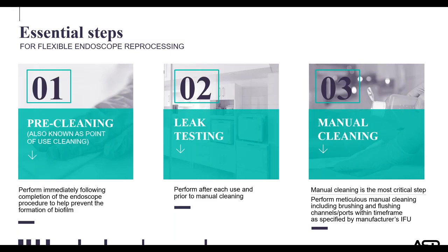And if a detergent or enzymatic adheres to that scope, it can impede the effectiveness of a high-level disinfectant or a sterilant. Use a clean brush for each scope cleaning and use the appropriate size for the channel being cleaned. Rinse and flush the channels meticulously.